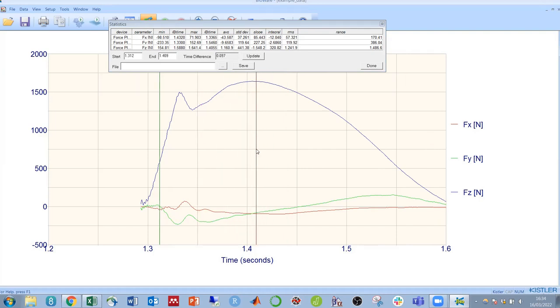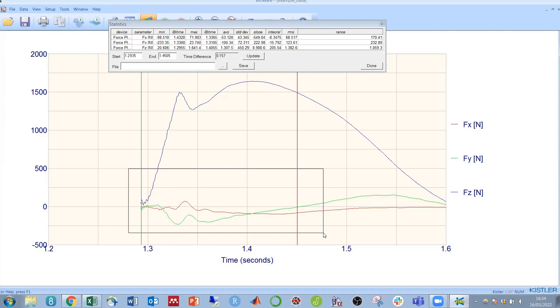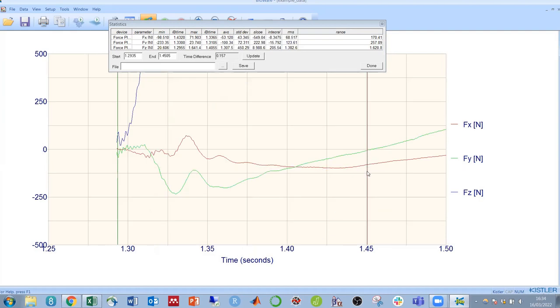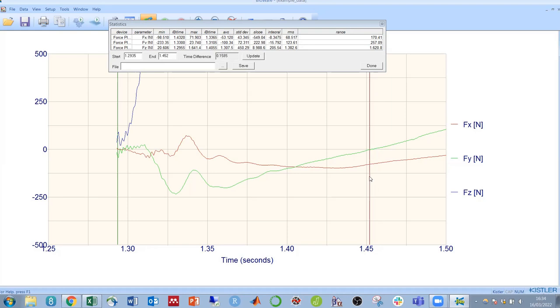For example, if we wanted to look at just the negative impulse in this green anterior-posterior direction, we can zoom in and look for the exact moment at which our force trace crossed the zero axis.